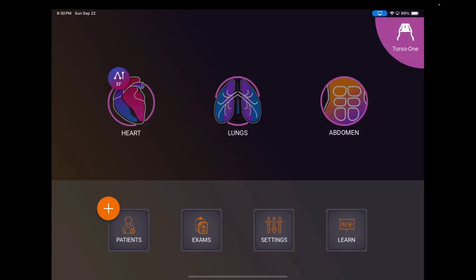Here we are on the ultrasound machine. You can see on the first page there's not that many options, which is good, and they're quite prominent. You can see heart, lungs, abdomen — whatever you want to scan shows up really quickly. You can add patients, review exams, get into your settings, and learn about the ultrasound. The probe is attached — I have the torso one, as you can see in the top right corner.